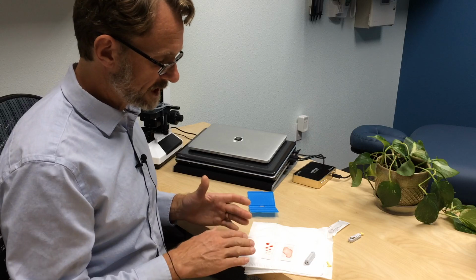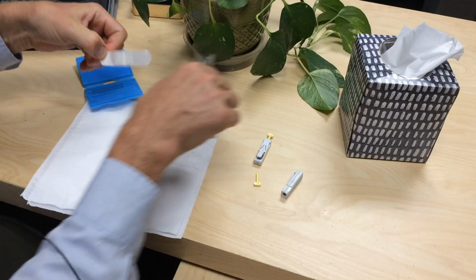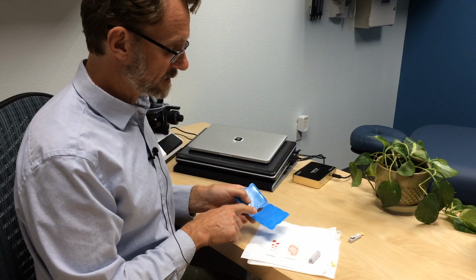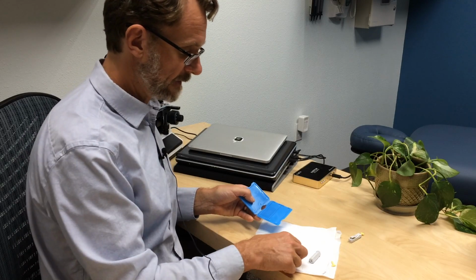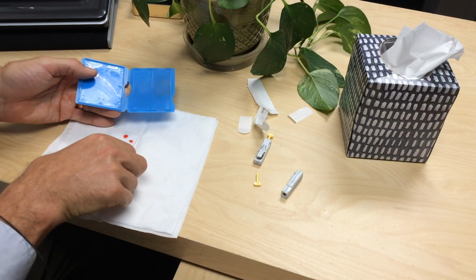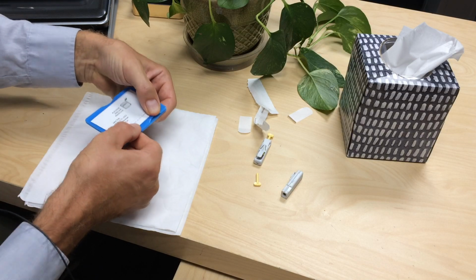If that whole procedure went well and you had no problems with it, you can now take the Band-Aid and apply the Band-Aid on your finger. These samples take about 5 to 10 minutes to dry. Once they're dry, if you didn't break the other slide cover in the procedure, you can leave it in the shipping container and then take both samples, take them face up, and carefully put them back into the microscope slide case, making sure they're in place, and then gently close this.